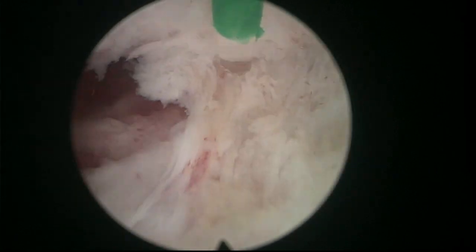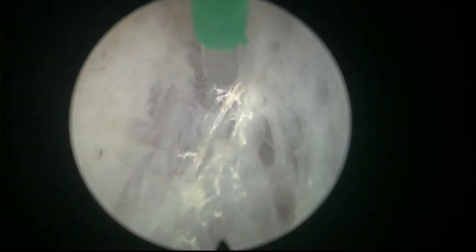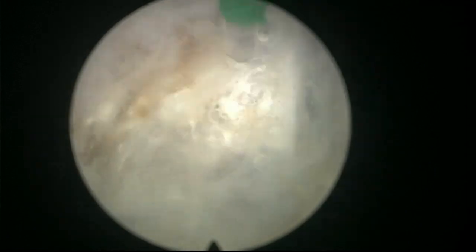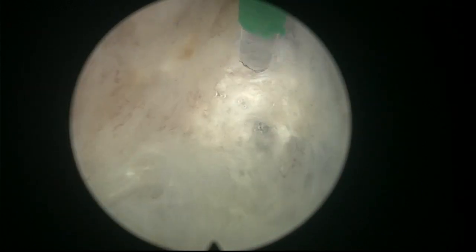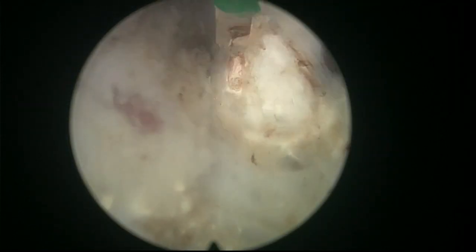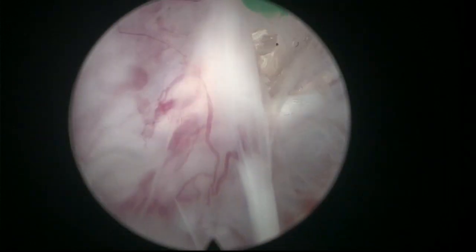Okay, this is a small discrepancy in the plane. Sometimes it happens when you go from the posterior to the lateral. Many times the lateral lobe pushes laterally, and the middle lobe pushes the capsule downwards. So in the confluence of the middle lobe and the lateral lobe, there might be some discrepancy in the plane. It's not that you are following the wrong plane, it's that you are dissecting two different spaces. Here is the lateral lobe footprint, and here you would get to the middle lobe footprint. So in between, sometimes you find a discrepancy. Many times you just have to cut through it to connect both planes. Okay, so I think it's enough for the moment. On this side, I'm going to follow the dissection circumferentially, trying to go to the other side and take it to a similar depth of dissection.